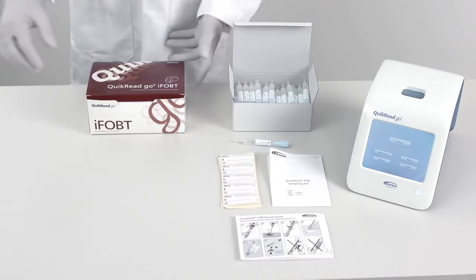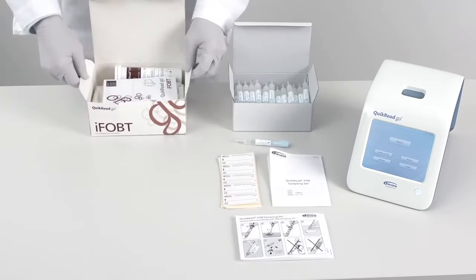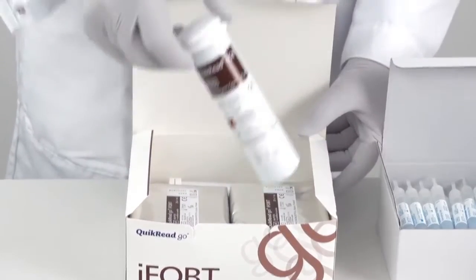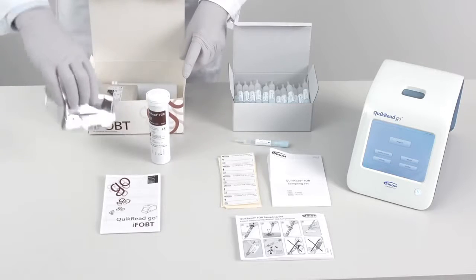The ready-to-use QuikRead Go iFOBT kit contains all needed components to perform the test. The kit contains instructions for use, two aluminium tubes of reagent caps, and two foil pouches with cuvettes.